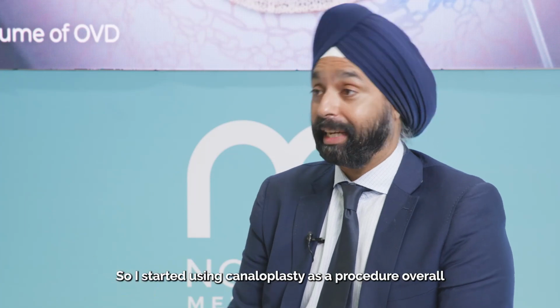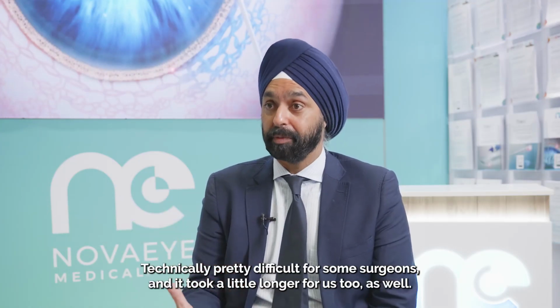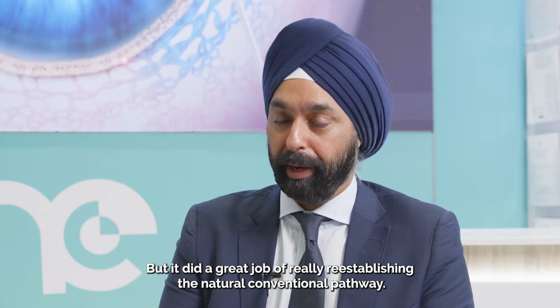So I started using canaloplasty, that procedure overall, a couple decades ago. It was a wonderful procedure, technically pretty difficult for some surgeons and took a little bit longer for us as well, but it did a great job of really reestablishing the natural conventional pathway.